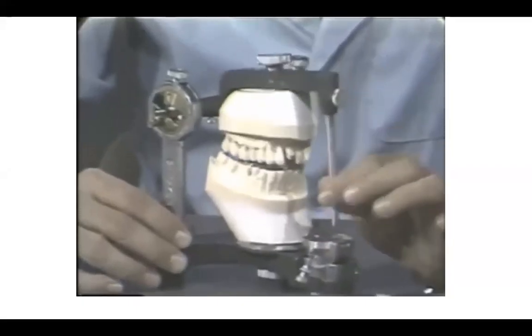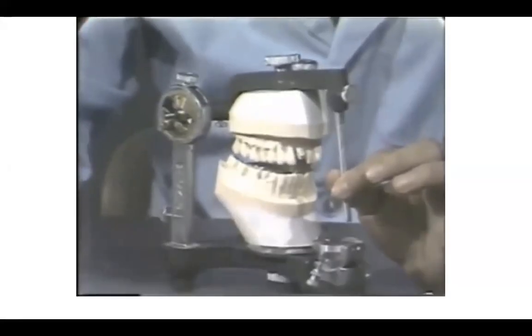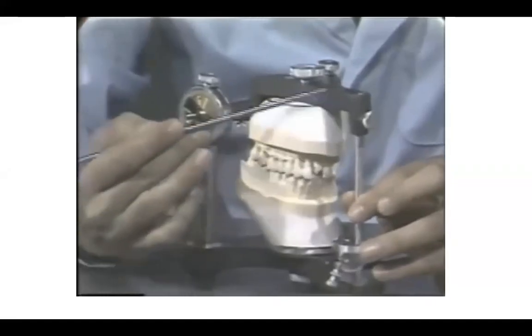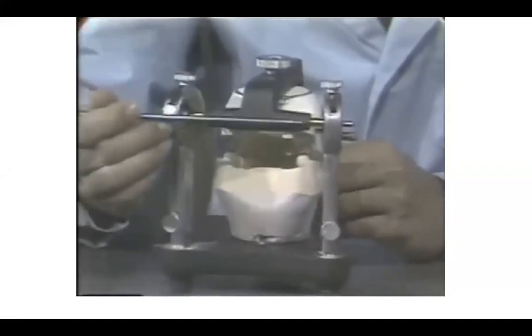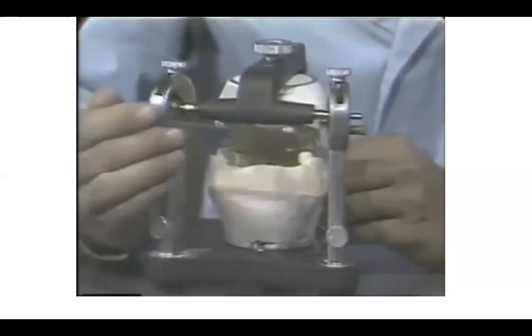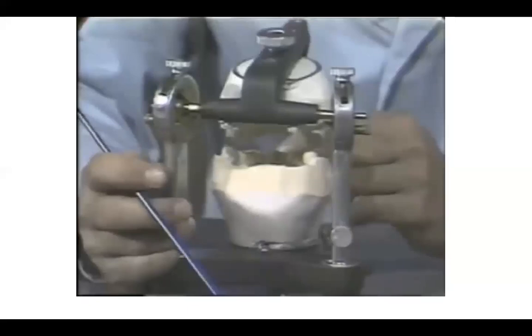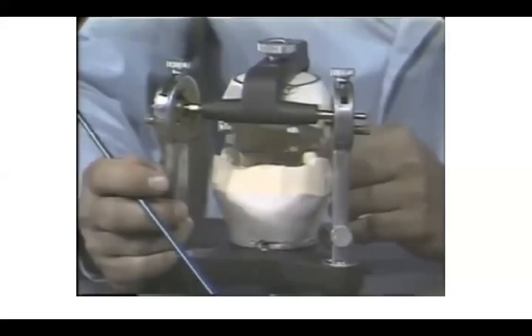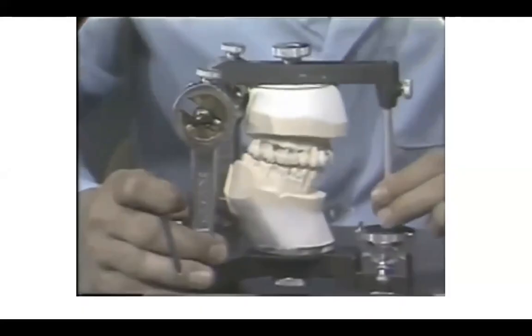Now, the upper part of this articulator that I'm arcing up and down is called the upper member of the articulator. It is composed of the upper member proper and, looking at it from the posterior, a horizontal axis, or transverse axis. The opening and closing movements of the articulator are centered around this transverse axis.